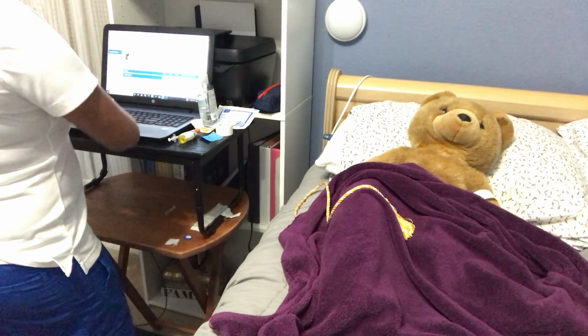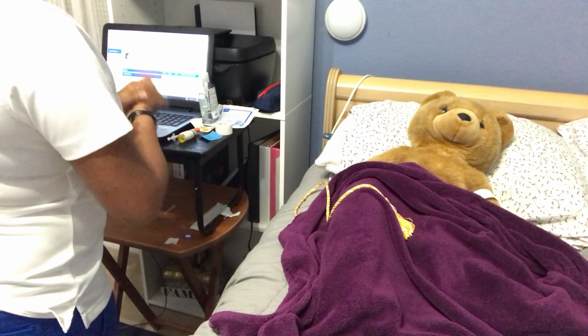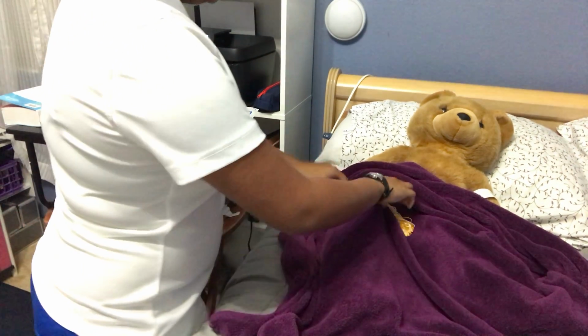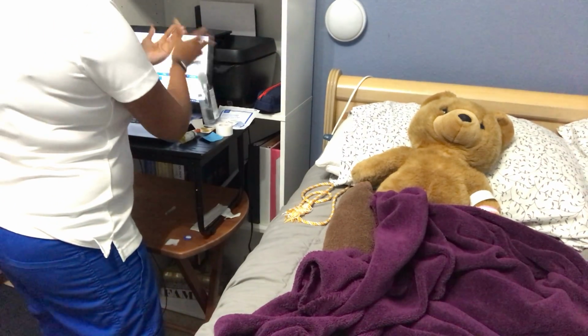Okay, all right, so I'm just going to clean my hands real quick. All right, Mr. Simpson, just relax, okay? What I'm going to want you to do is I'm going to expose your blanket, okay? And I'm just going to expose so I can see your leg, all right? I'm going to clean my hands again.